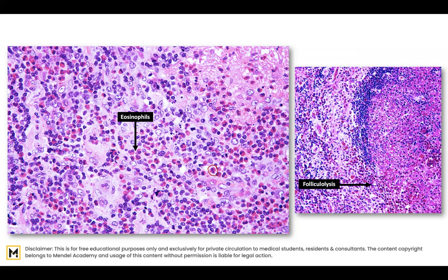The second feature is the presence of follicular lysis. What you can appreciate here is an entire follicle, or part of a follicle, where the dark blue area of the mantle zone seems to have been cut off. The follicle has been lysed and is being penetrated by eosinophils from the paracortex. Follicular lysis — breaching of the follicle and invasion by eosinophils — is another important finding.